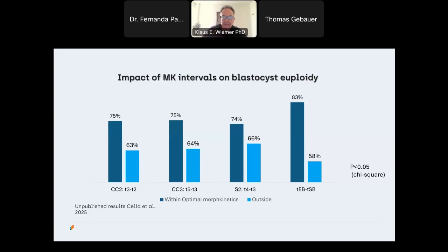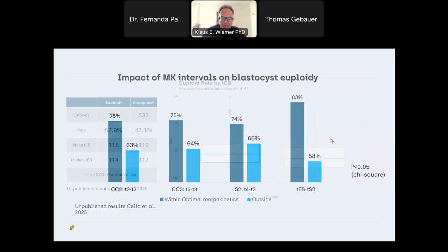And why is this important? Well, because I think that we could start to utilize this data to actually start to do transfers without having to do embryo biopsies. We may be able to move to a point where, say, patients under the age of 35 with embryos that have good developmental history, more than likely they're euploid, so we could reduce the need to do things like biopsies and having to ship off these cells.